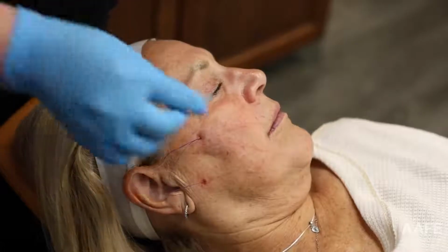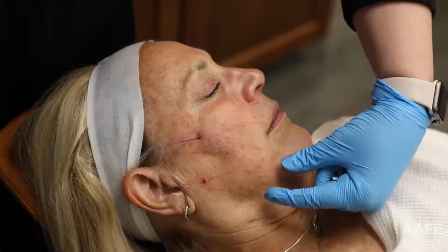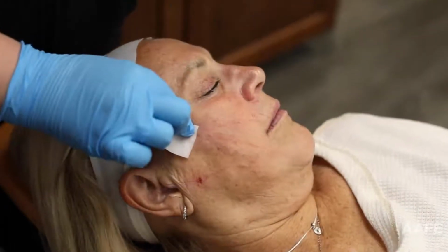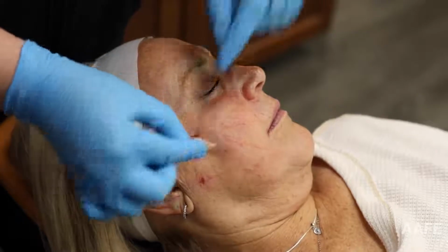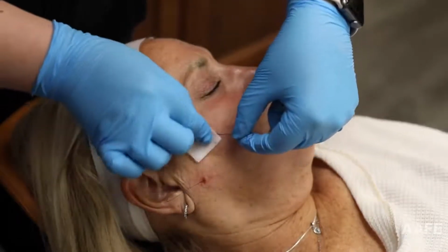So we sat her up, and I was looking, she got an amazing result already, but I do think I just want one more to this jowl to really help pull it up. So I'm just gonna go right into that same vector that I've already been into and just give her one more, and then we'll cut.